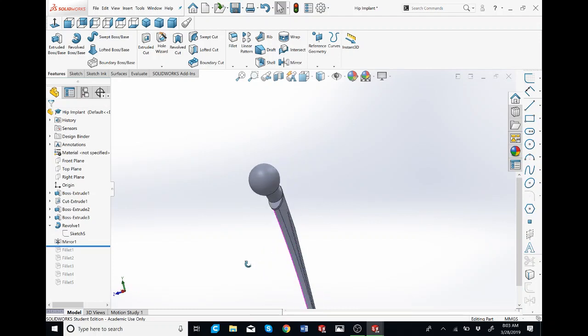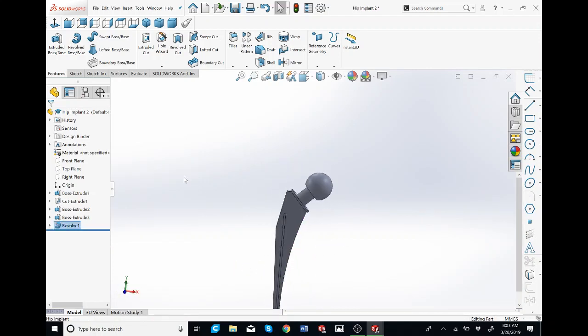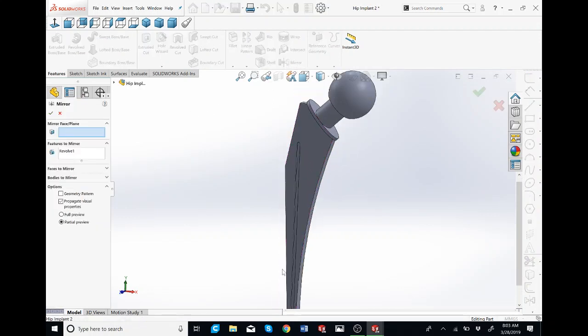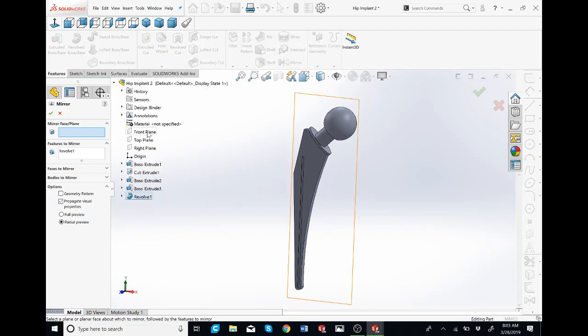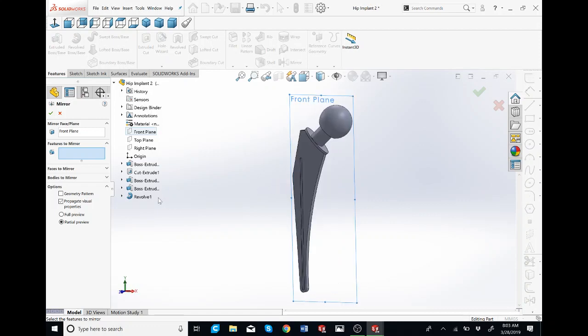There's a mirror. What mirror does is it makes this cut feature go on the other side. So we'll do that really quick. I'm going to go to the features tab and we'll click on mirror. I'm going to zoom in real quick and rotate it so you guys can see it. I'm going to click on this arrow button and I want to mirror on the front plane. I'm going to delete this because I don't want to mirror the revolve. I'll mirror the cut. This is the reason why we had this box extrude as mid-plane, so that we can actually mirror, make it symmetrical.